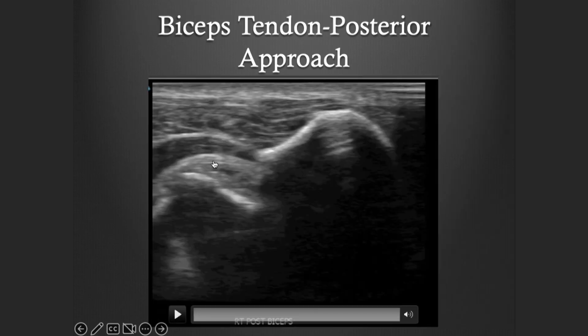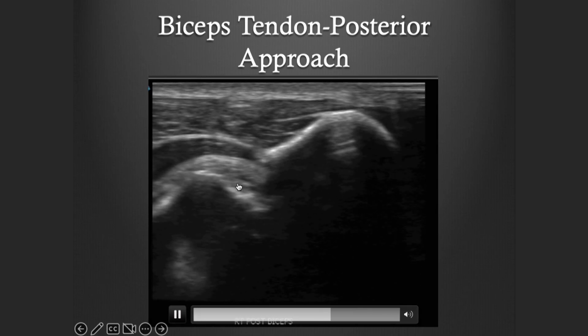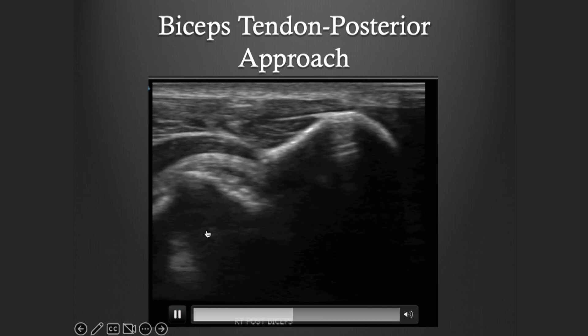Here's a video of that. This is the ulna, here's the radius, and as we do pronation and supination you can actually see just the little beak of that biceps tendon coming out as we run that video going pronation and supination through here.